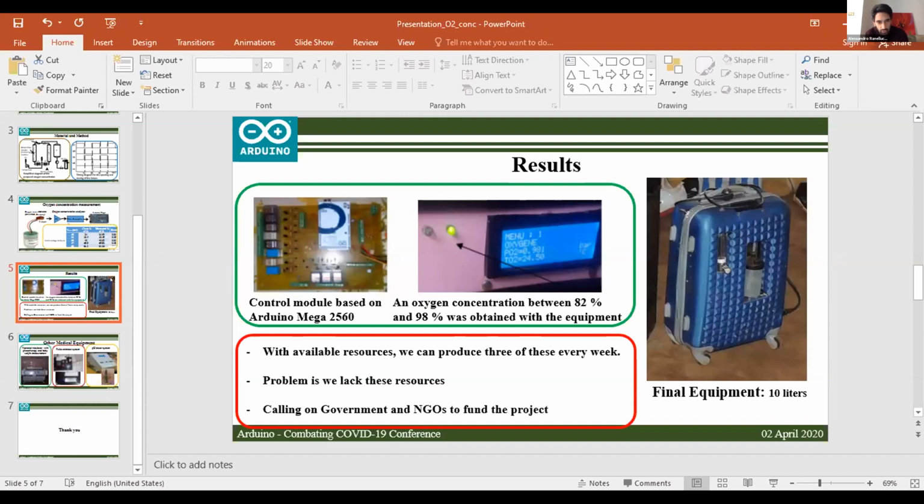First off, I would like to understand how did you validate this project? Did you involve doctors in your team? Are you running tests in a clinical environment? Yes, we worked with doctors because I am working at the university hospital. In the development, we worked with doctors in other places to validate before it was supposed to be used. We had to take a sample of the oxygen that was concentrated and test it in a laboratory to evaluate that concentration. Based on that, we calibrated our system to give that concentration.